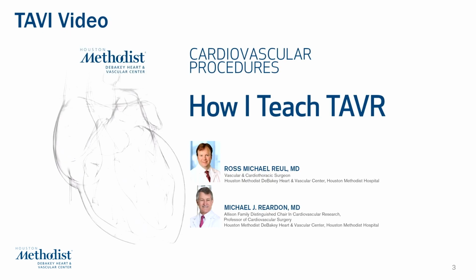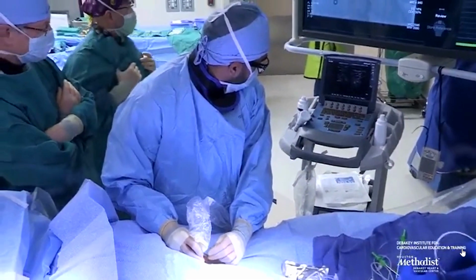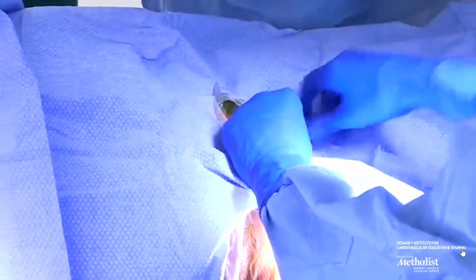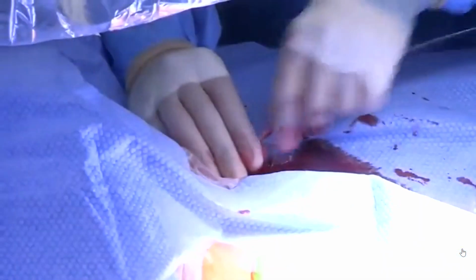This is a video that was recorded a while back. It shows some things that were done as we did them at the beginning of our TAVR experience, and then some things that are done now. Every procedure starts with us repeating the measurements so that we get the right valve that we're going to put.